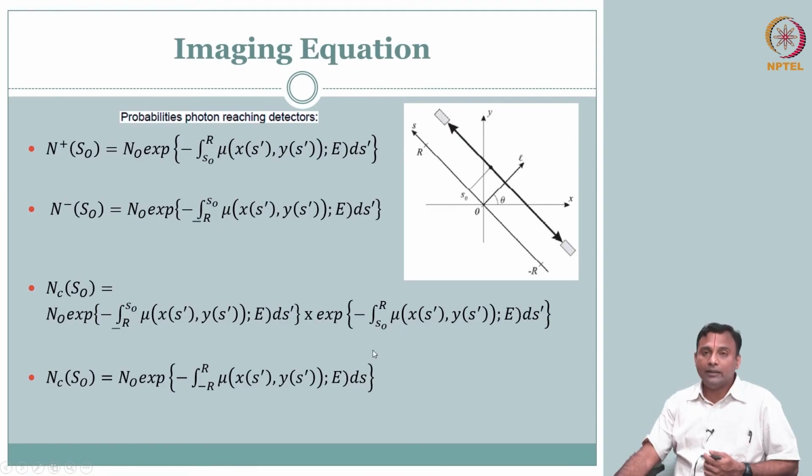So, now you see the advantage, at least maybe you do not see it yet, but you can recognize already that this is a big deal. This is simplifying our problem a little bit. All this multiplication, that coincident criteria helped us get these limits, which is from minus R to R. So, in some sense what you are recording is the total loss along the line here. If you are not able to spot the advantage of this, we will see it in one more slide.